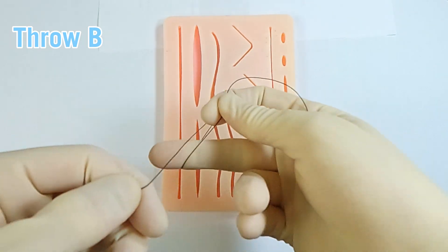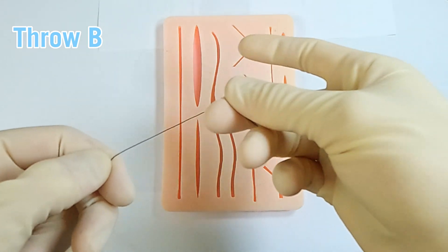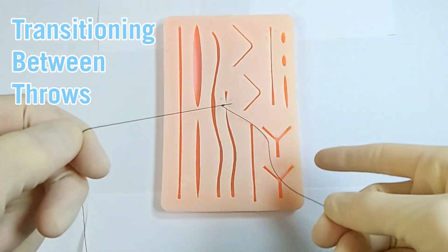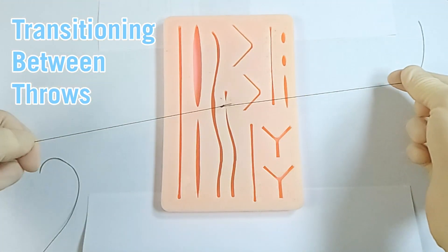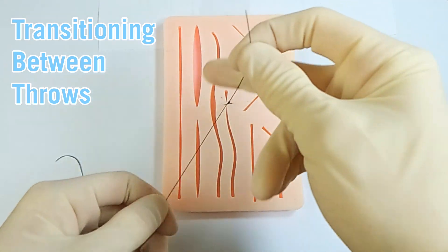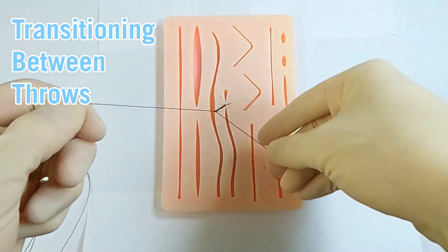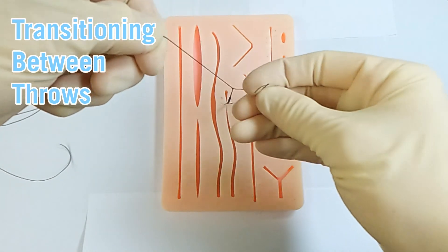Here's the one-finger version: post over, flex, over, under, extend, bring the suture material through. Now this shows how you can ideally transition between throw A and B without ever re-gripping. Notice how I finish throw A immediately ready for throw B. And then set up with throw B, I can go right into throw A and complete my knot.